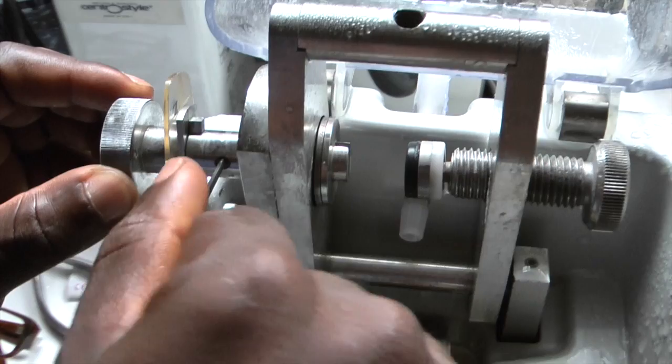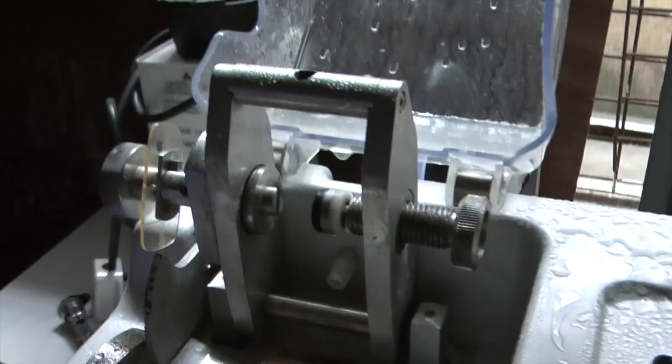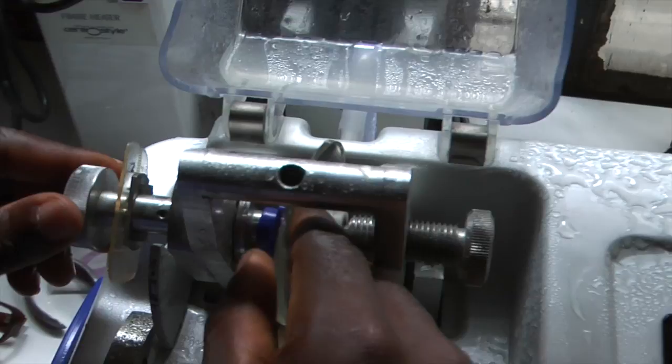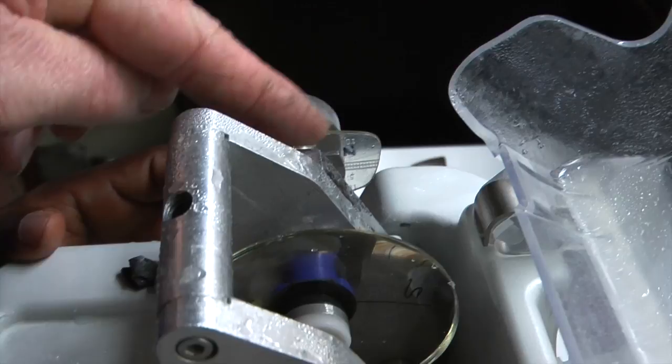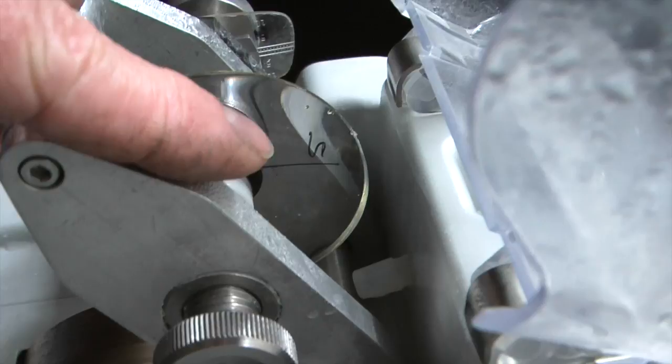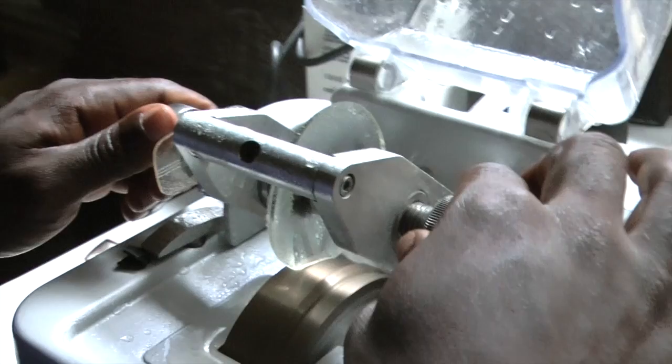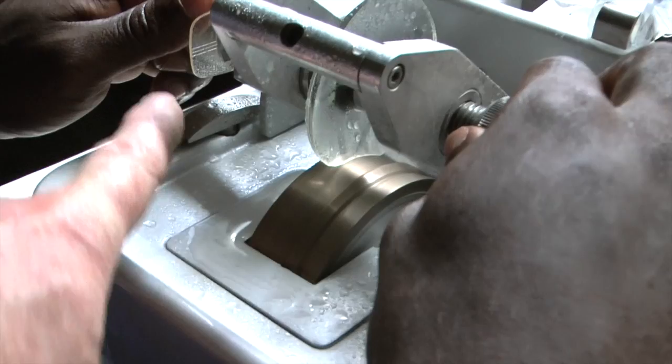Shakespeare is going to put the lens in now. Make sure that the end of the lens is facing the same direction. Put the lens in - you can see the nasal end on the former is there, and we can see the nasal end on the lens is here. It's very good when cutting the lens to keep an eye on this as well, so you're looking at the former as well as the lens.